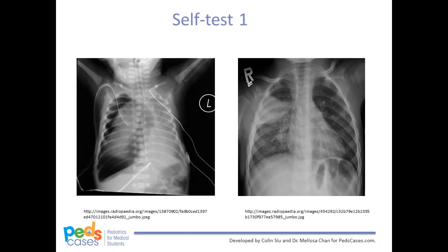This marks the end of our video on an approach to interpreting pediatric chest x-rays. The following slides are a quick self-test for interpreting pediatric chest x-rays. A chest film will be presented, after which you will have approximately 10 seconds to think of your diagnosis — feel free to pause the video if you need more time. After 10 seconds, the pathology and diagnosis will be given. Six chest films will be presented for the self-test, followed by a list of online resources for further information on pediatric chest x-rays.